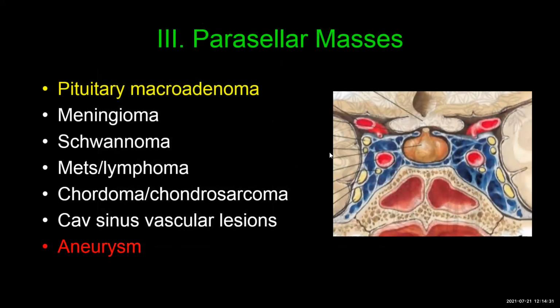All right, so we will finish up the last minute or so with parasellar masses. We've already talked about many of these.